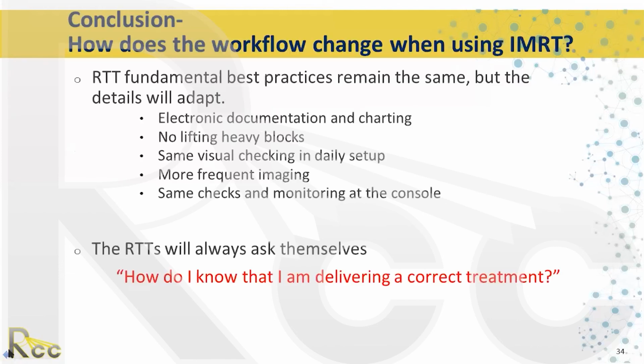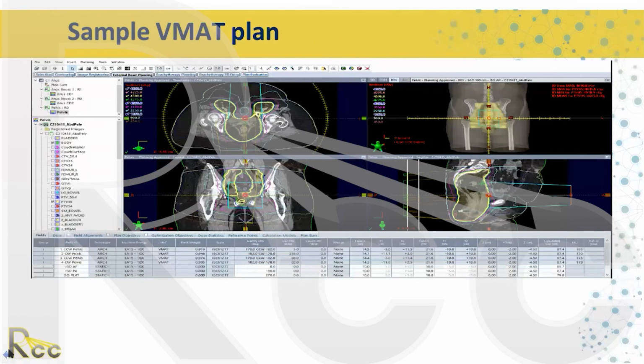Let me see if I can find a picture. So you could see how in this, the beam is not just a straight field. It kind of changes. So the way IMRT works, this is an arc plan. The radiation is adjusted from all directions so that you get this intense amount of radiation to the PTV, the treatment area of interest, and the rest of the area, like the femoral heads and stuff, is blocked.